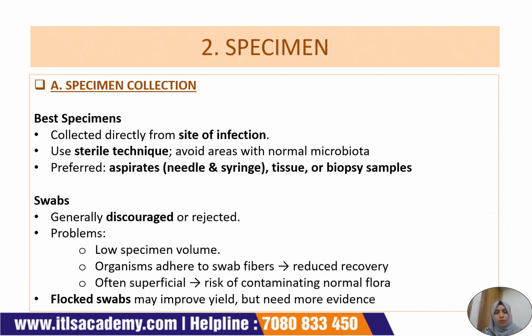So in part 2 of anaerobic bacteriology, we will discuss in brief about specimen types. What are the transportation methods? What are the processing, how specimens are processed clinically, and about the microscopic examination in detail. Okay, so let's begin with specimen collection.